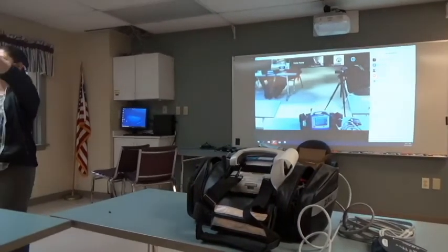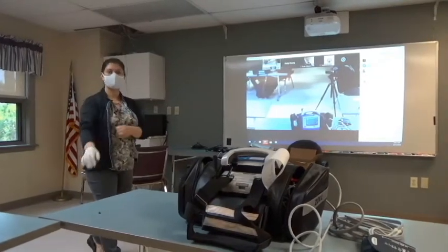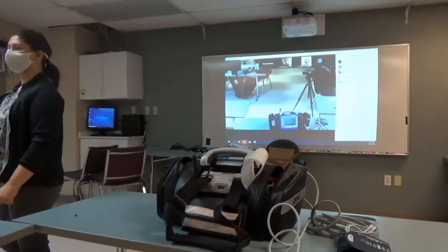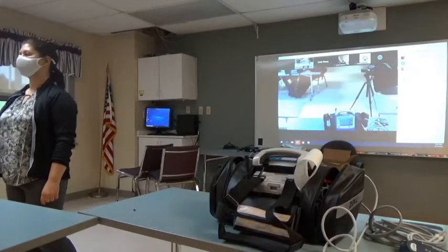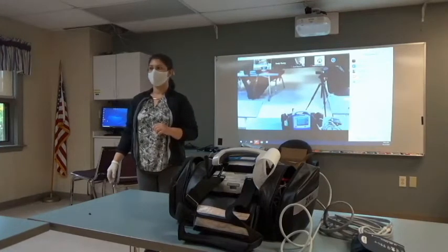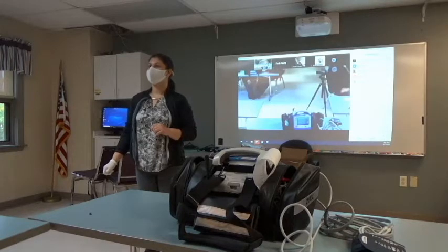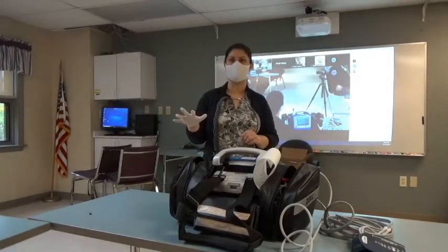So you'll get a picture view of the 12 lead now. Yes. Can you do that if you already, say you click out of this 12 lead view, can you send the most recent 12 lead? Yes. That is actually where we're going next. That's a really good question. All right, I'm going to show you guys where your archive is at. Do you guys have any questions for me on how to transmit?